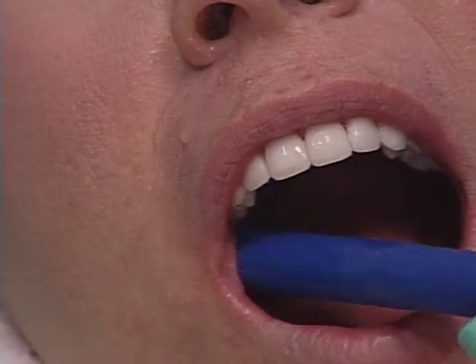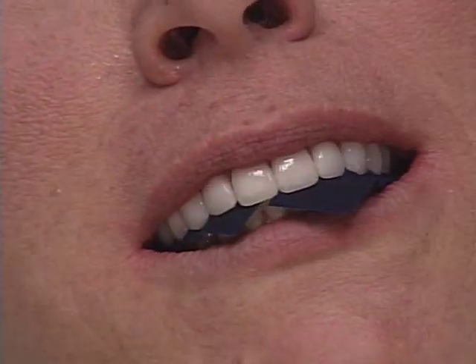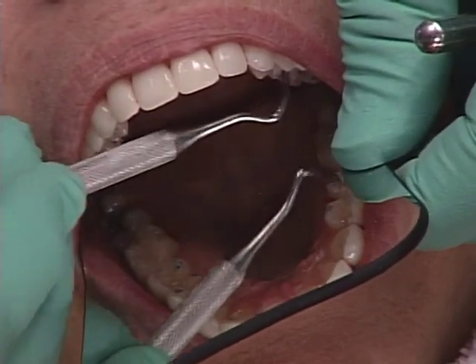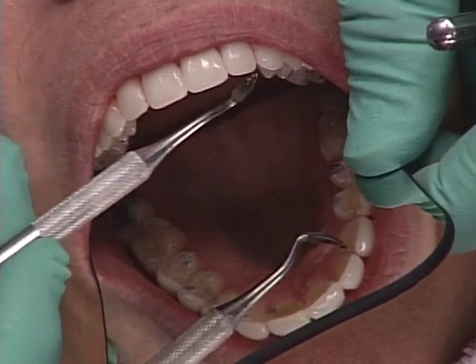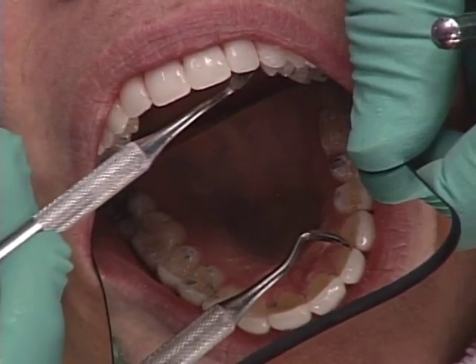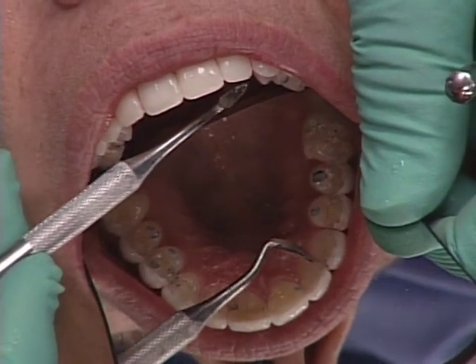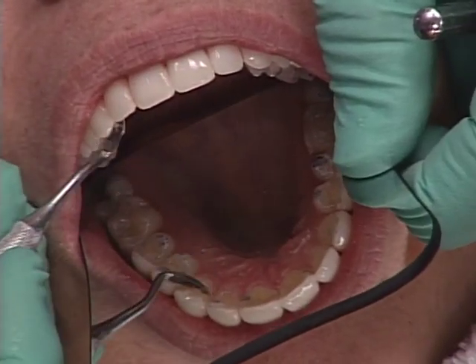Now before we open the contacts, let's check the occlusion. And close. Gently grind your teeth around, forward and back. Look at all of her spots. She's closed in centric. Natural tooth, natural tooth, natural tooth. But look right here. You see this distal, that lateral? That lower cuspid of hers is going to want to go forward and knock off the distal of the lateral. We've got it over here on this tooth as well, on the right lateral.